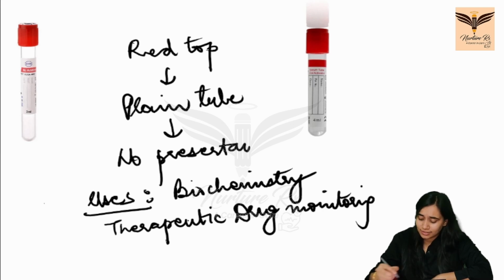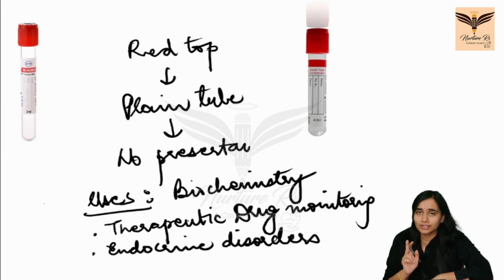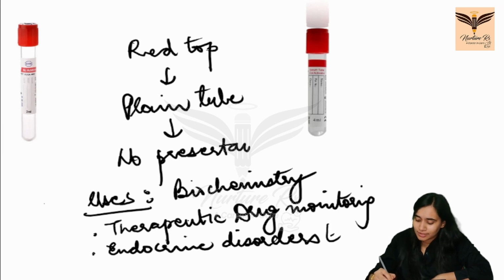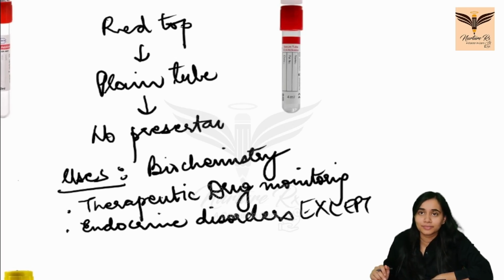Another test is that it is used in the endocrine disorders. All endocrine disorders, and the important thing is except what? Thyroid. Thyroid test is done in a separate tube.